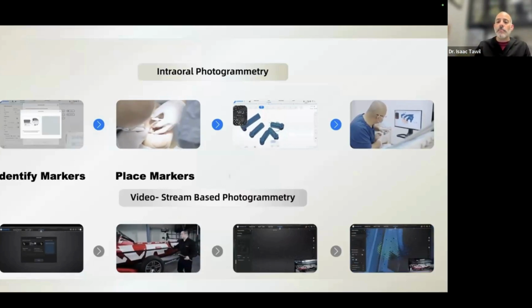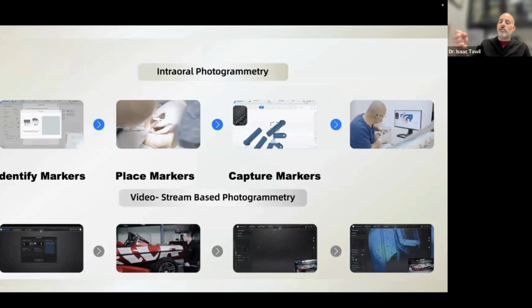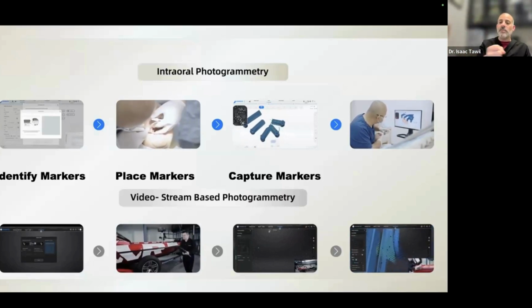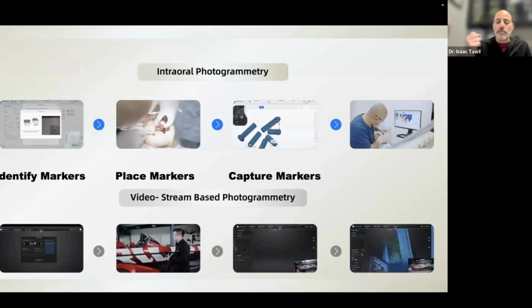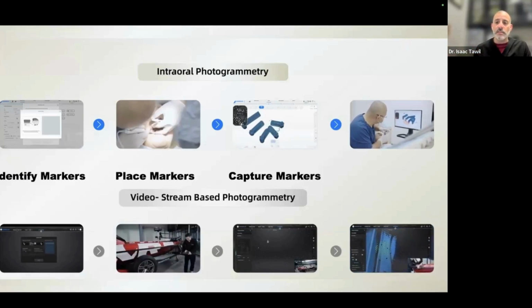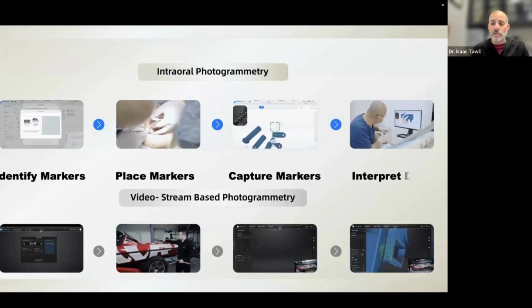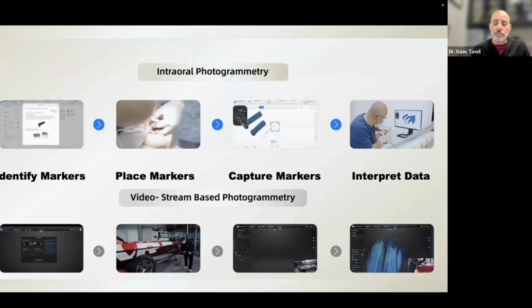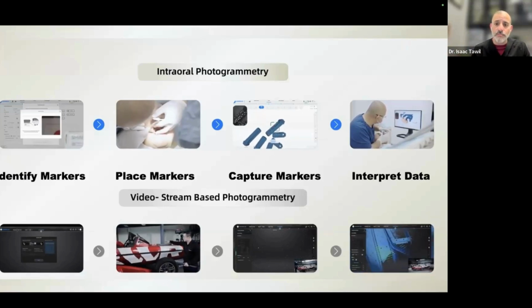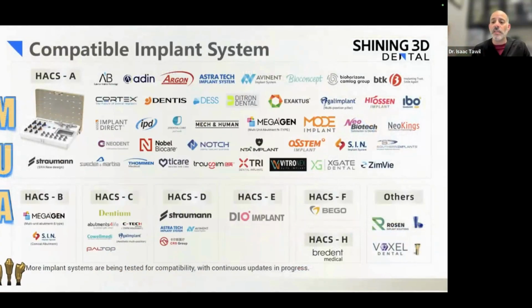We then pick up our magic wands and we go ahead and we capture. In the industrial sector, we would use these handheld devices that go around the boat, around the building. In the mouth, we're using an intraoral scanner basically that has this photogrammetric component. And then we can interpret all that data inside the software to give us the precise implant position or multi-unit position. And we work with all of these different companies. We have different kits. Some are available, some aren't FDA approved just yet, but this is all what's coming.